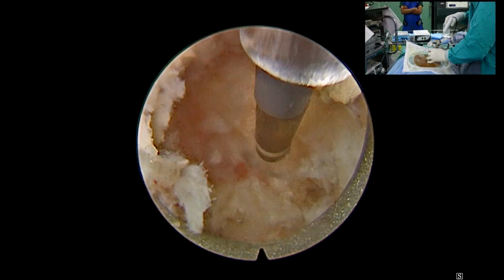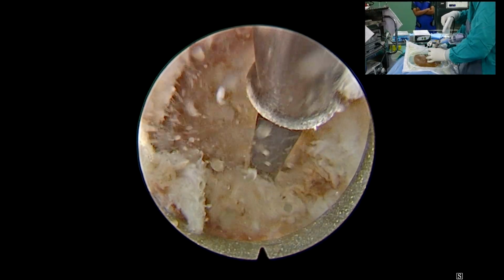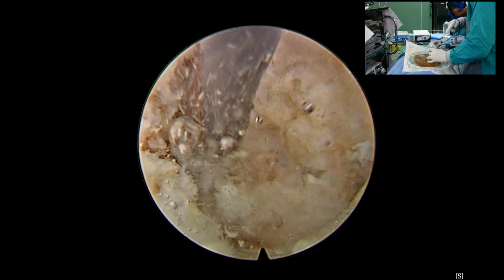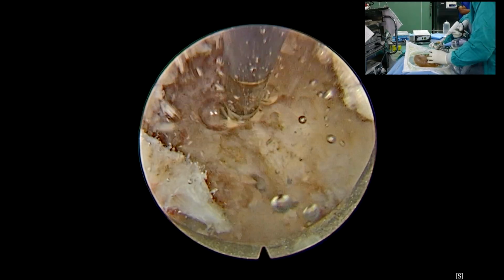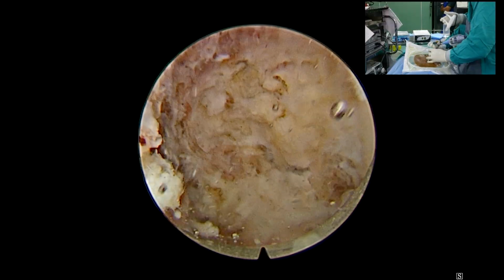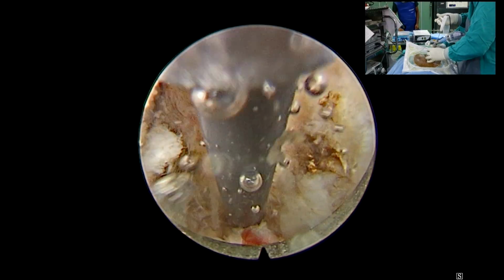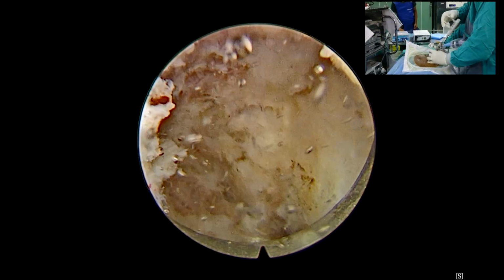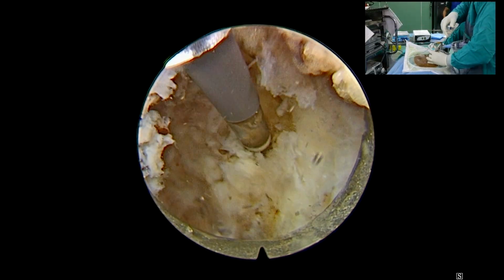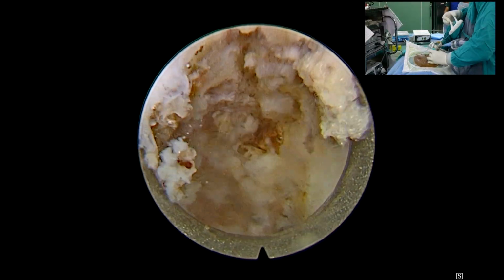We are using the second irrigation fluid. We must keep a watch over the irrigation fluid numbers also. Many times we might end up using 8 to 12 three-liter bags of NS, meaning 24 to 36 liters of irrigation fluid in known cases of posterior endoscopic lumbar decompression. There are many complications of fluid irrigation.